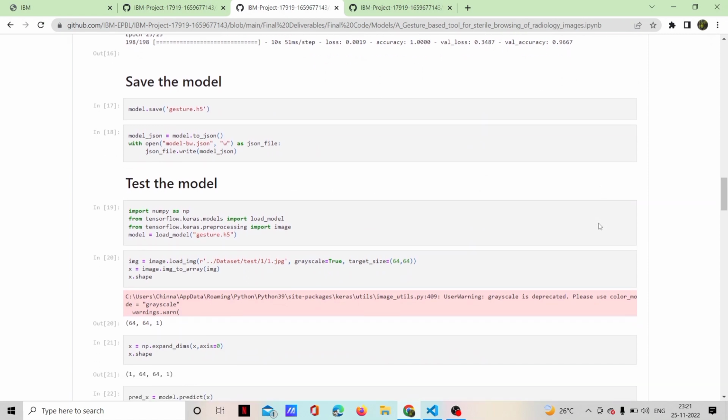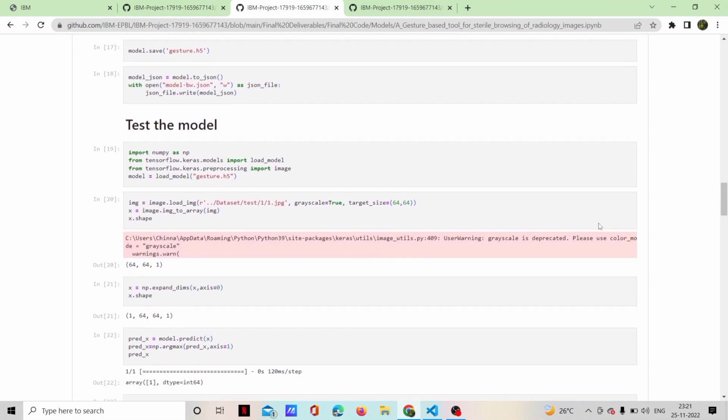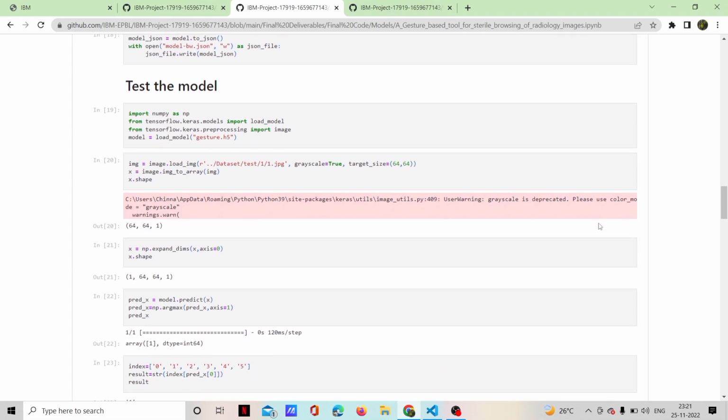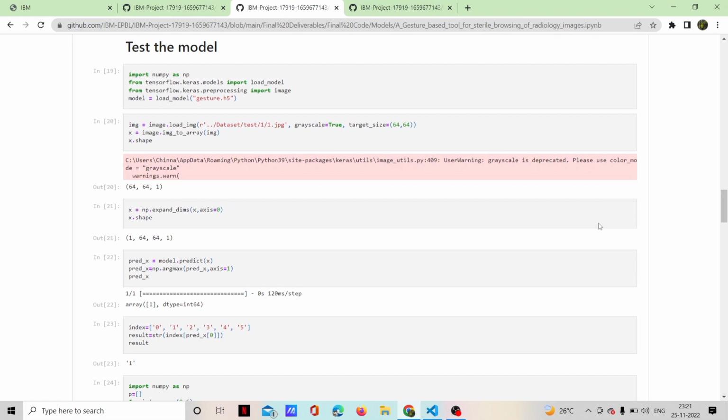So after training the model, we test the model. The images are loaded and then we import some more packages like matplotlib, which is used for plotting. Then the results are predicted. Here the model is built and trained successfully.